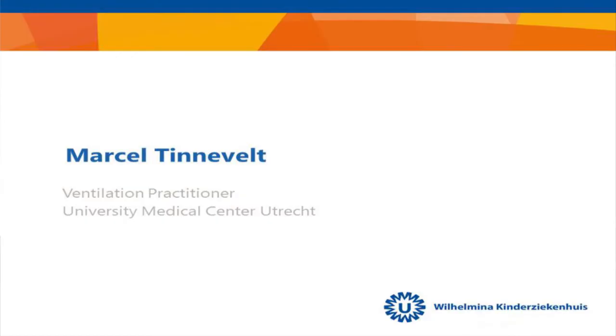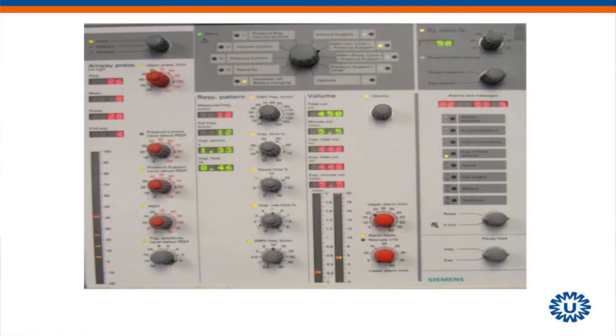That's possible. Watch. It's not so long ago, just a few years, we ventilated with this machine. It's a Servo 300, and there were no waveforms and loops. So it's possible that you use a machine that has no waveforms and loops. Is someone using a machine without waveforms and loops? No loops, only waveforms. What machine do you use? Drager. Evita 4. Babylog. Okay.